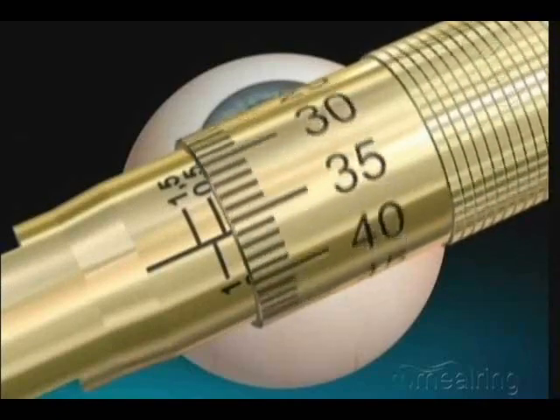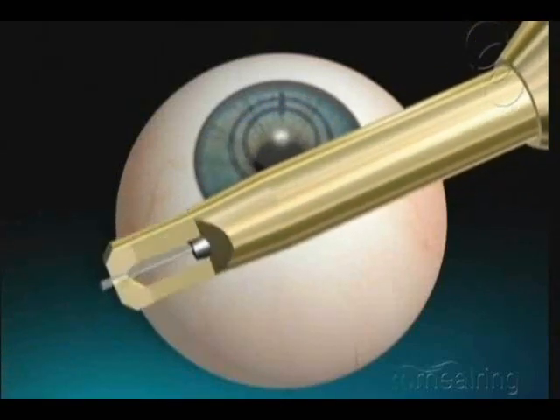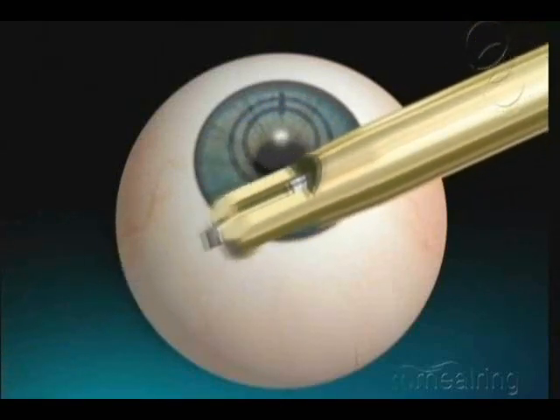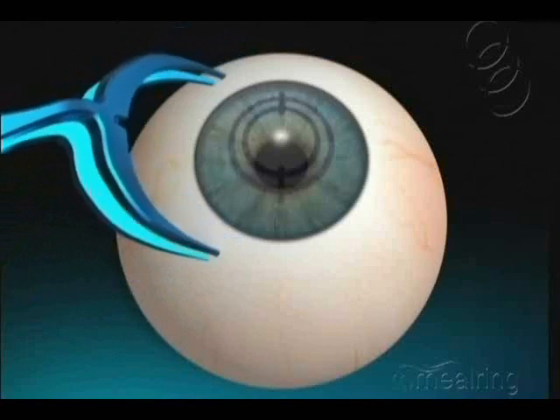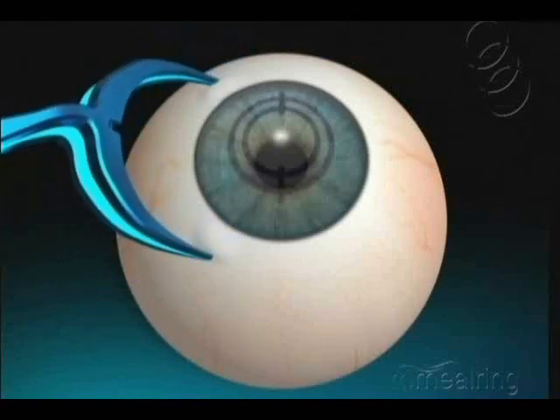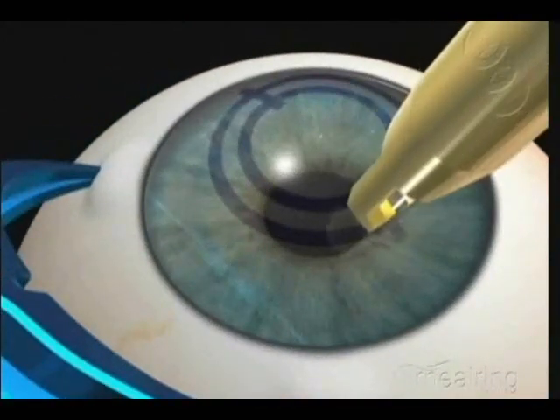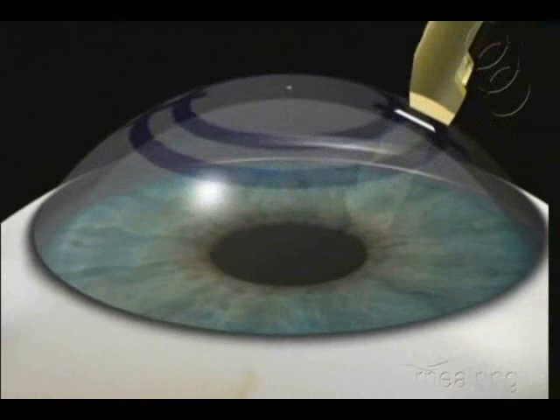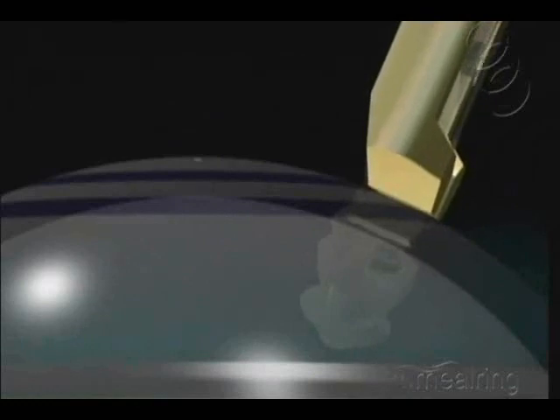Hold the eye still using a Kremer forceps, which should be attached next to the limbus. The diamond blade touches the corneal surface at a right angle. Make the incision with repeated and small radial movements. The blade penetrates into the cornea until blocked by the stopper. You don't need to use force, just see-saw movements.